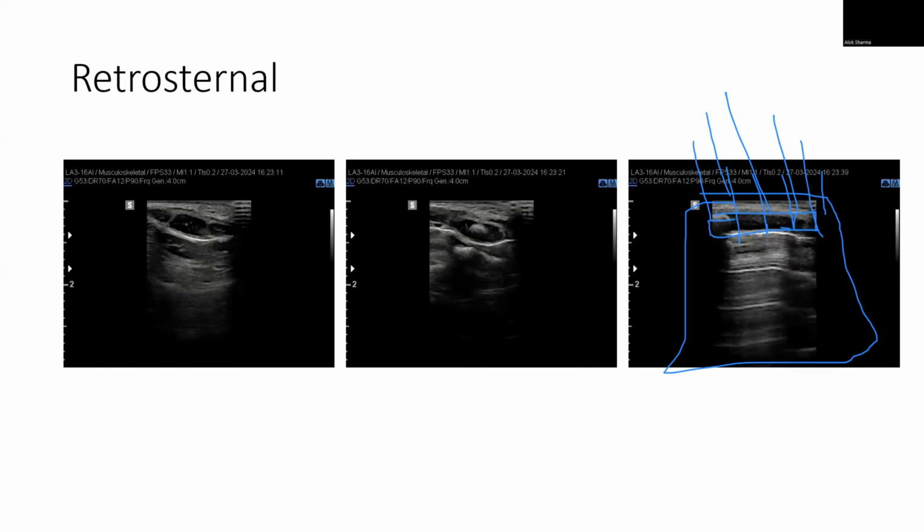There is an article that I'll send to all of you today, which looks at some of the newer science for describing pneumothorax, specifically the incidence of diagnosis of pneumothorax in relation to the medial sternal edges. And just remember another article which says that if you're very near the sternal edge, often where the pleura interfaces with the medial part of the lung, there is less sliding.